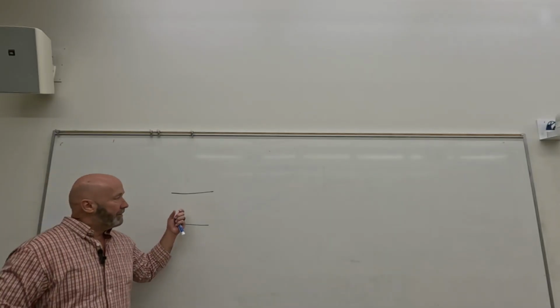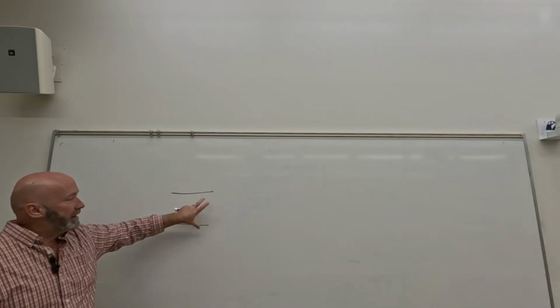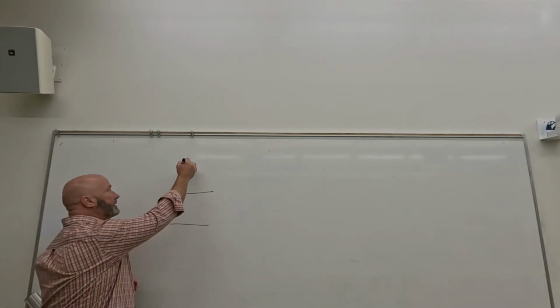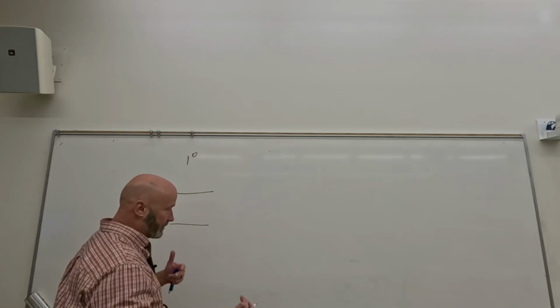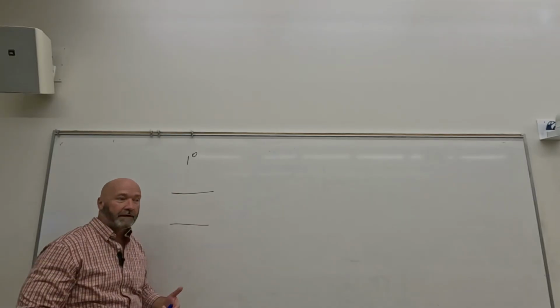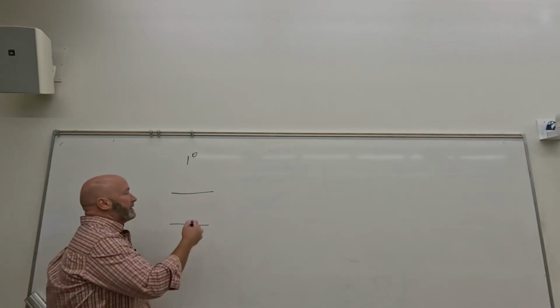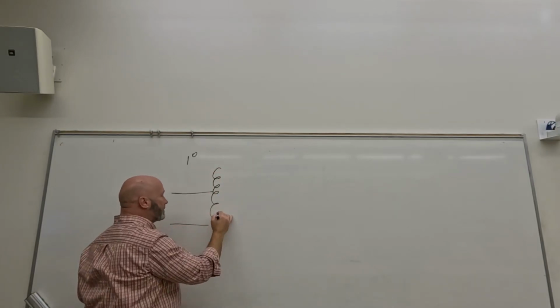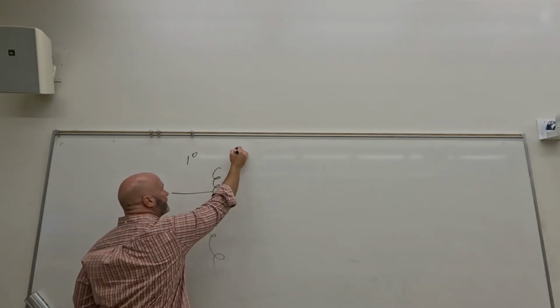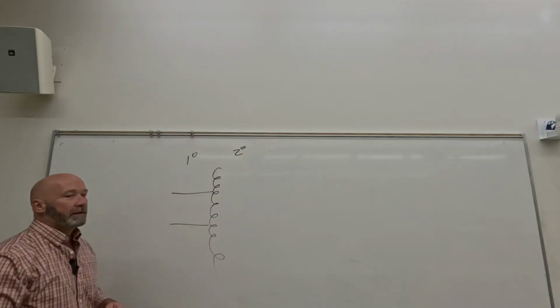So what I mean by that is that we have specific contacts. Which side would we call this? Supply the primary side with alternating current. Remember, we always have to have alternating current up at this point. So we have fixed contacts on the primary side, and what we do is we adjust the contacts on the secondary side so that we can adjust voltage.